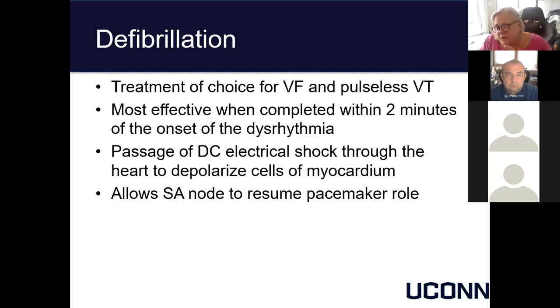What's the difference between defibrillation and cardioversion? Does anybody know? With defibrillation, we have either a pulseless rhythm or disorganized activity, and there's nothing to sync up to.